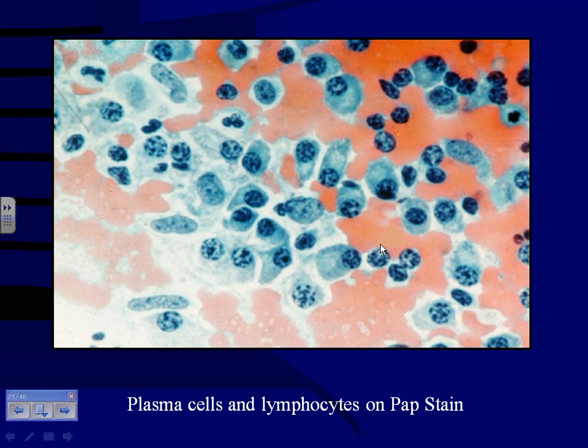Plasma cells, again, nice picture with the clock-faced chromatin, the eccentric nuclear placement, the Hof zones.